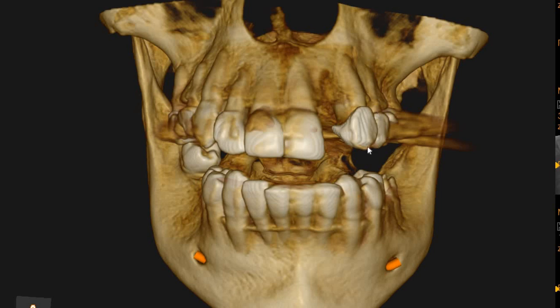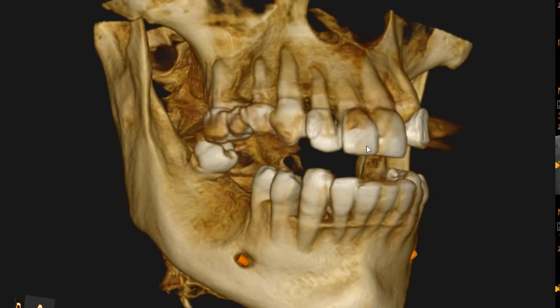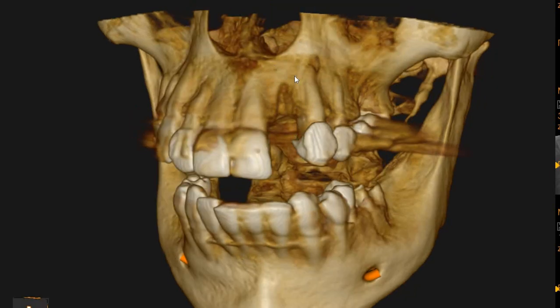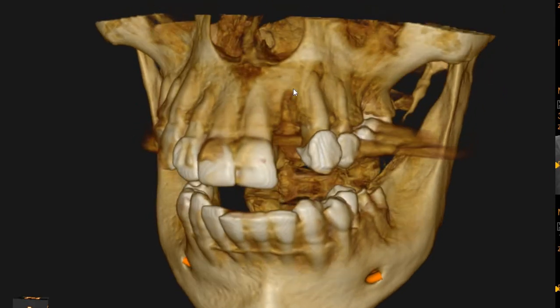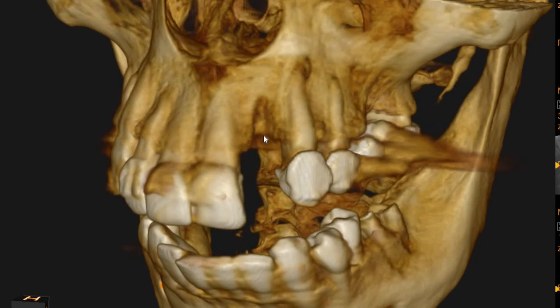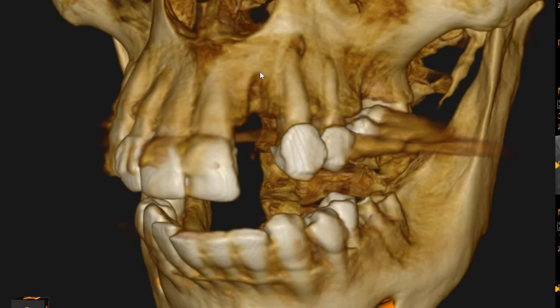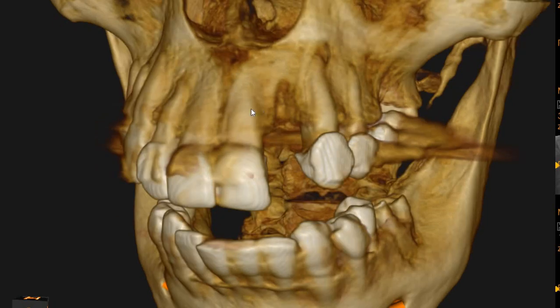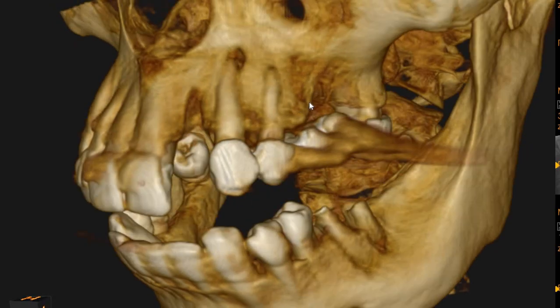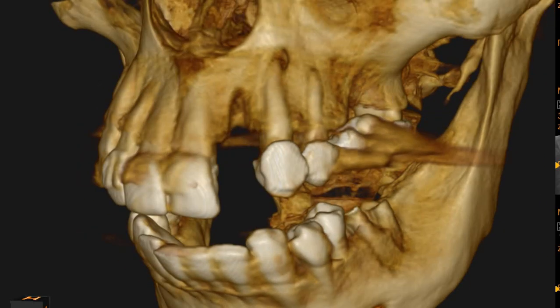Hello and Asalaamu alaykum. Ultrascan Diagnostics. This is the 3D rendering of the patient you had requested. The area of interest is the upper left lateral incisor region. This tooth has had an extraction — this is the edentulous area. We can see the extraction socket, and we can also see that the buccal plate has suffered damage at the time of extraction.